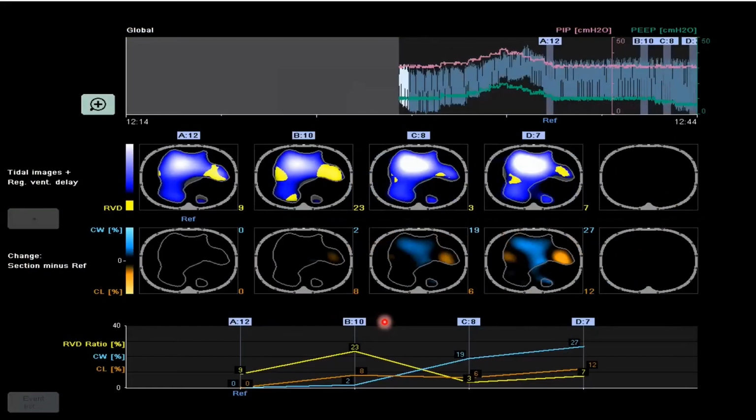In fact, I redid it with a PEEP of 10 down to 7, because 10 was the best compared to 20, but perhaps 8 or 7 could have been better. And we see over here, the blue appearing. Now the blue here in this one, this screen, we have a PEEP trial, and we also have a custom analysis. In this one, I'm actually using custom analysis.